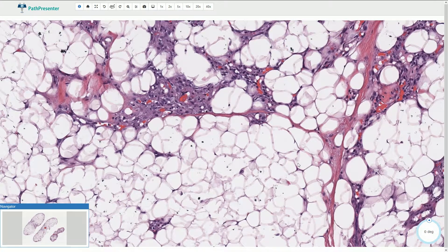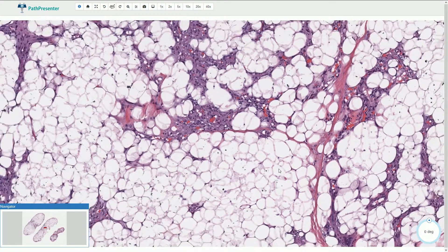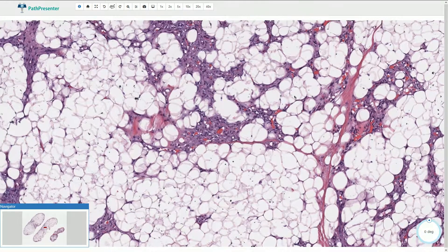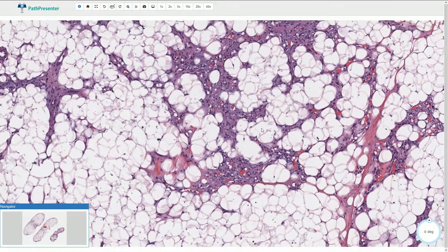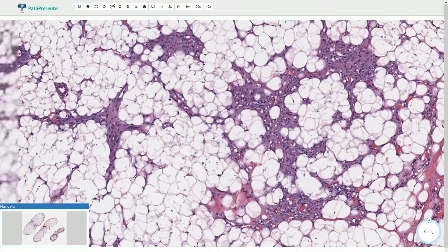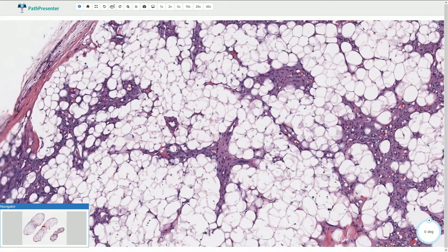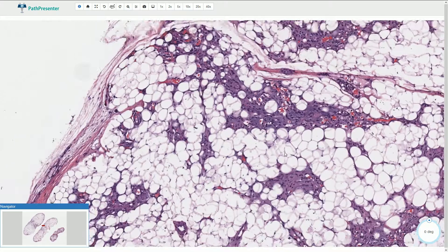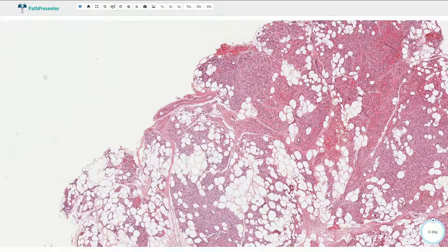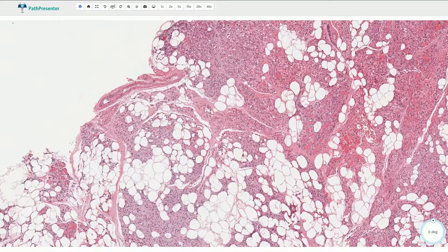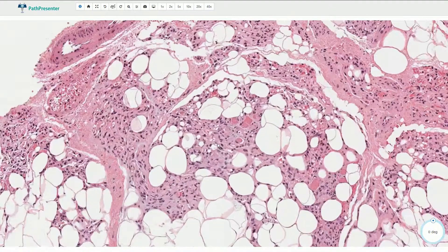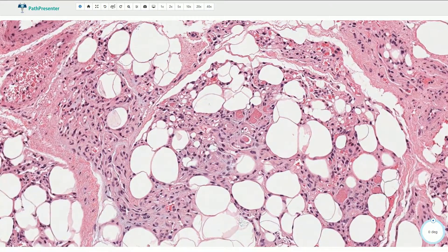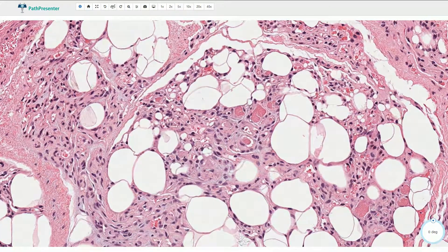We can find some blood vessels also in a normal lipoma. However, here the vascular component is more prominent and most importantly it is associated with intraluminal fibrin thrombi, which is a diagnostic sign. In this different case we can see the adipose component, the vascular component, and clearly visible fibrin thrombi in all of these small blood vessels.